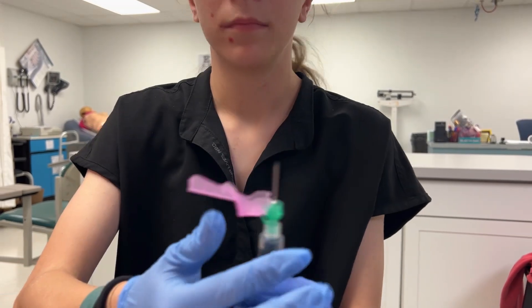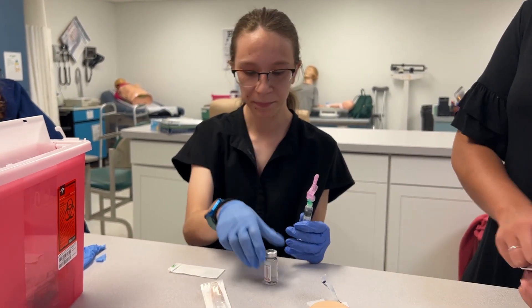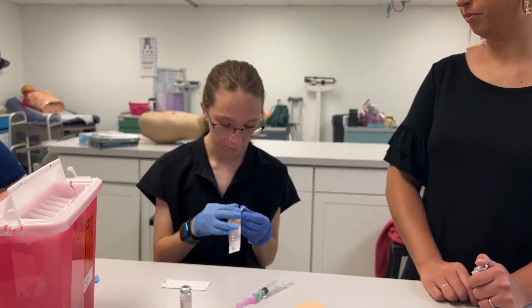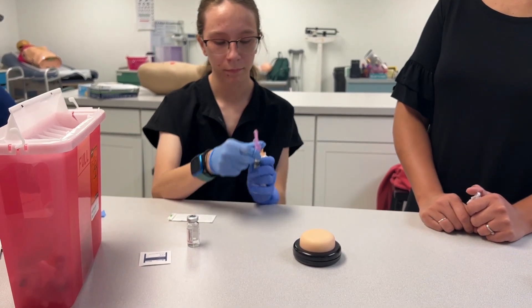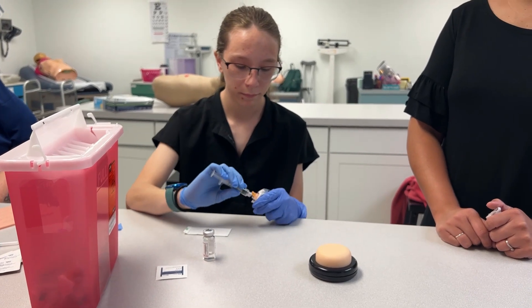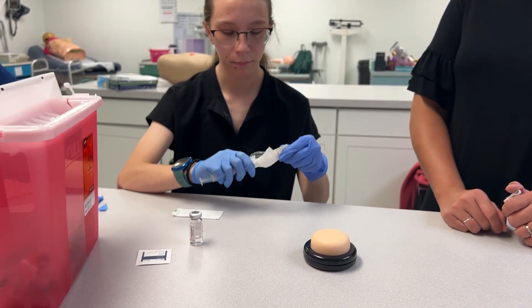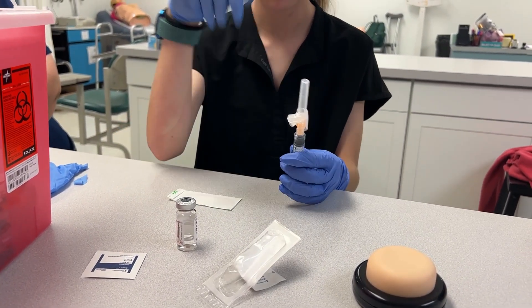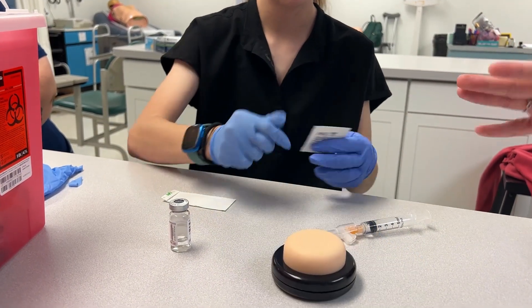Activate your safety device and go ahead and switch your needle. Some syringes come with needles on them already — the ones we used today did not. Good job putting that straight into the sharps. We also want to never recap our needles if possible; we can use the scoop method, but we prefer to use a safety device.